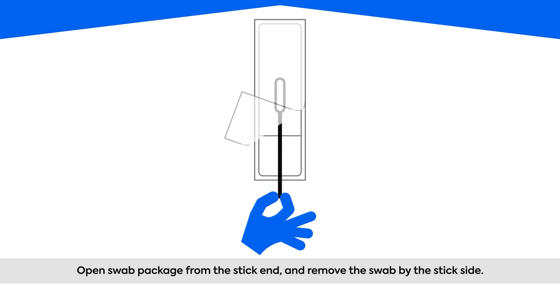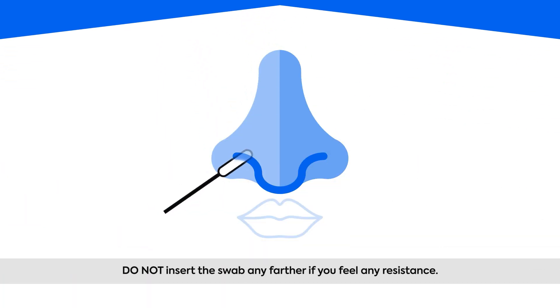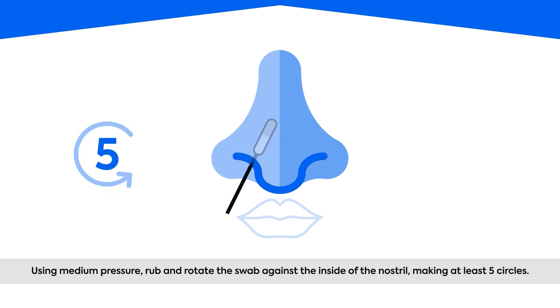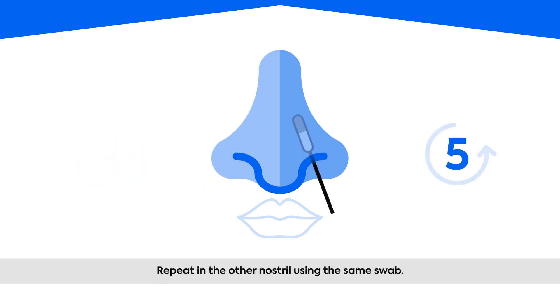Pinch the stick end and slide the swab out without touching the rounded swab head on the other end. Make sure you swab both nostrils. Inaccurate test results may occur if the nasal sample is not properly collected. Do not insert the swab any farther if you feel any resistance. Using medium pressure, rub and rotate the swab against the inside of the nostril, making at least five circles. Repeat in the other nostril using the same swab.